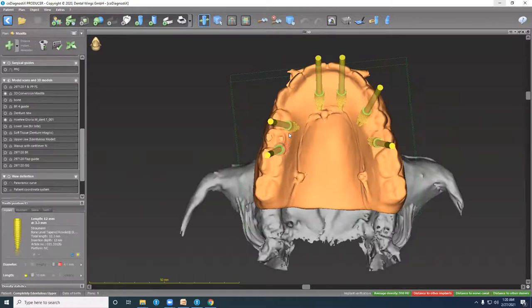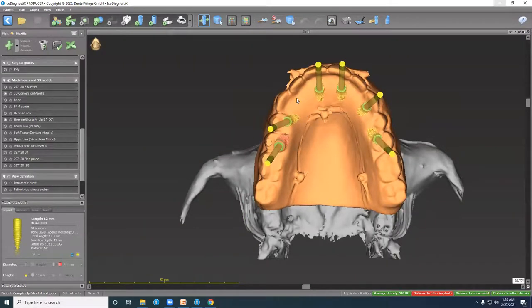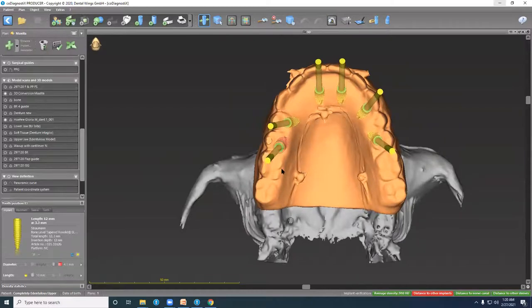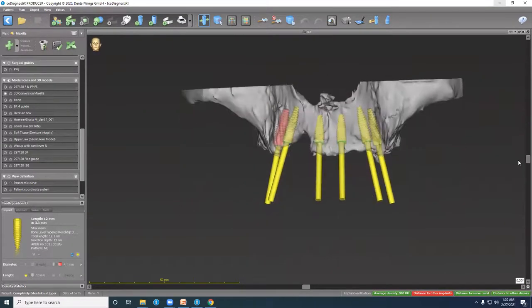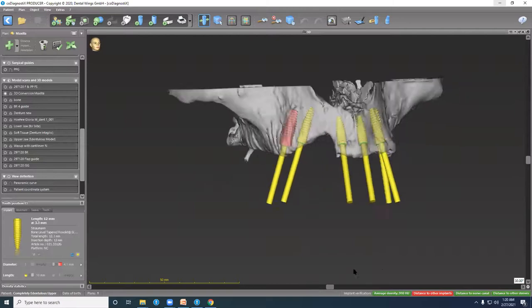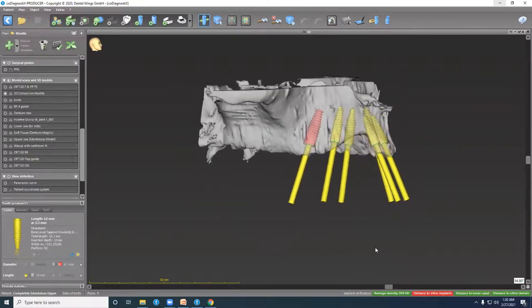A very important thing in FP3 type of restorations is the AP spread. Ideally, you will need implants at the key positions, which are the cuspid, first molar, and at least one implant in the anterior region. Here, we try to avoid the defect, as we notice from this view. And that's why our implants are tipped more distally on the right to avoid the defect.